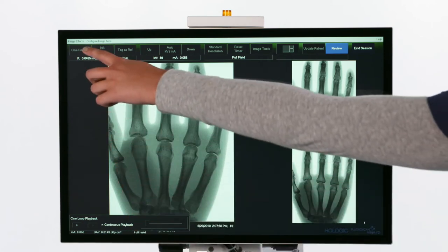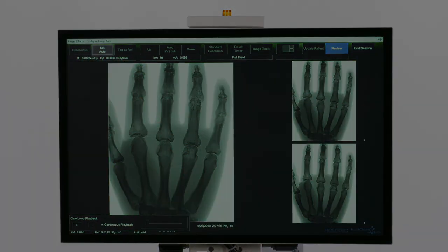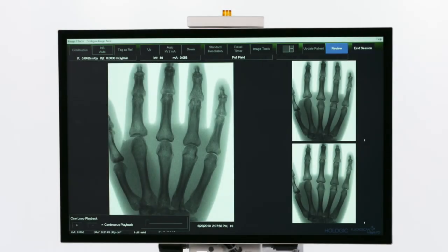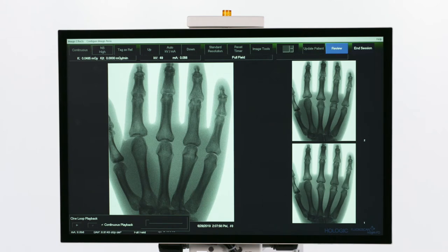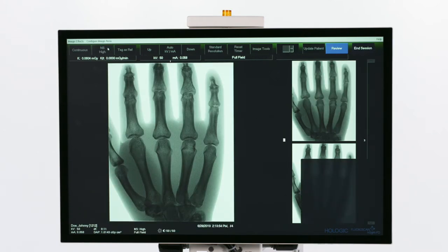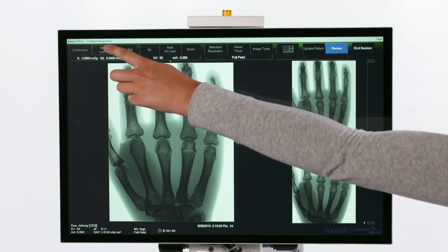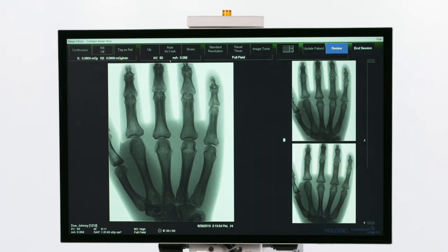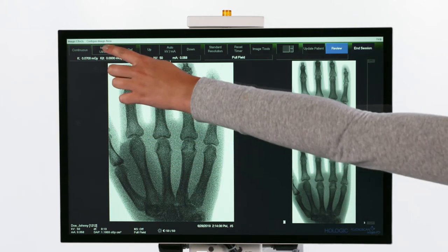You can choose the level of noise suppression by pressing the NS button in the function buttons bar. High or Ultra should be used when there is no motion of the anatomy and high image clarity is needed. When in motion, noise suppression should be turned off. Auto mode varies the setting depending on the motion detected.